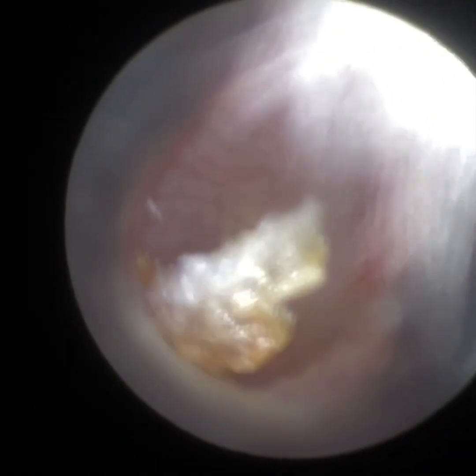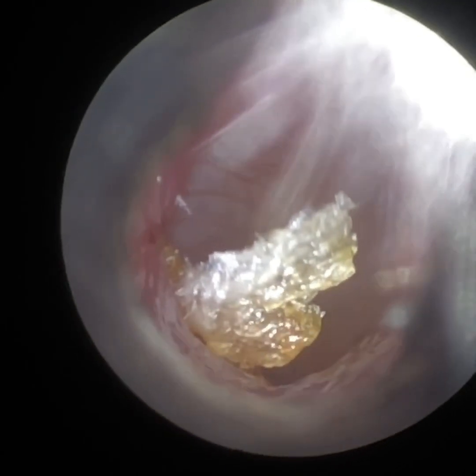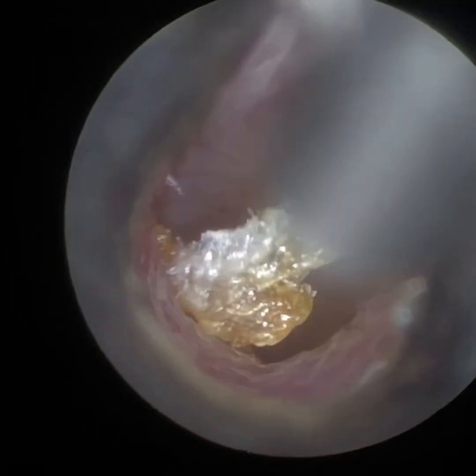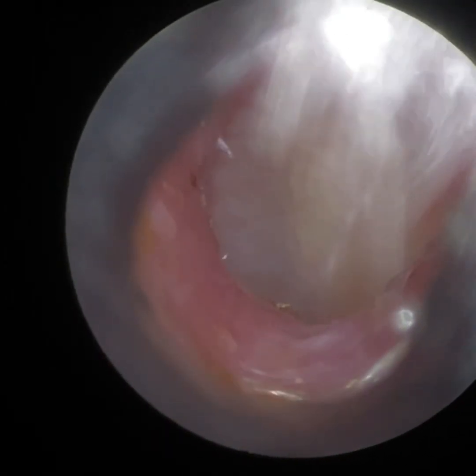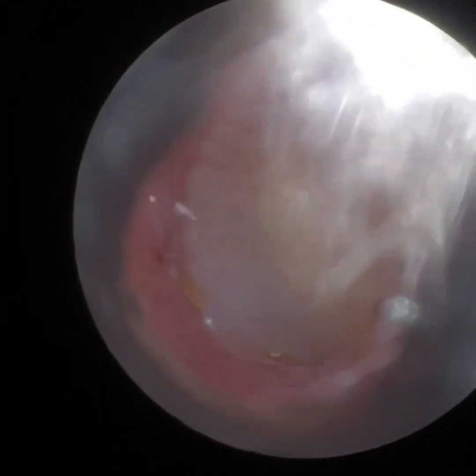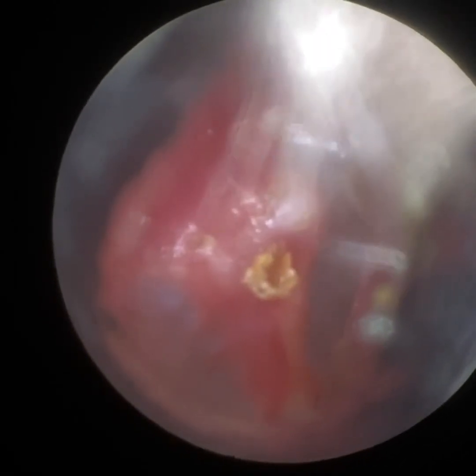I'm going to straighten it now, coming back the other way. You can see there's a bit of dead skin very medially. The patient has got a bit of superficial otitis externa, a bit of eczema and psoriasis — you can see the ear canal's a bit red. I've recommended some acetic acid spray over the counter. Let's have a look at the eardrum — we can see all the capillaries and blood vessels there.